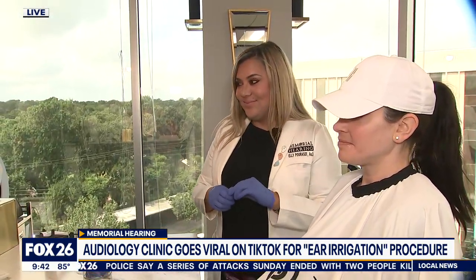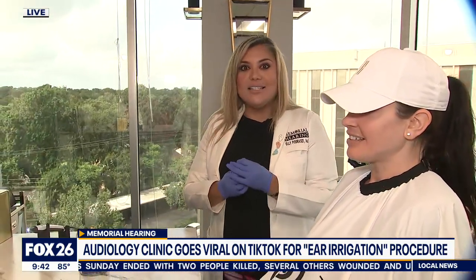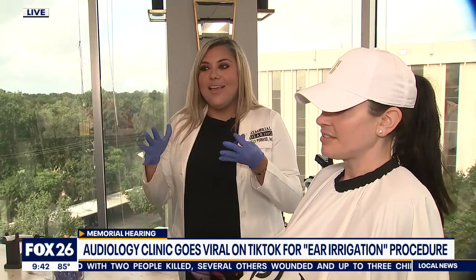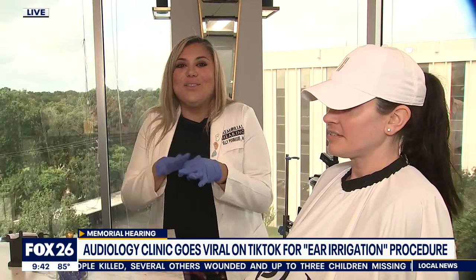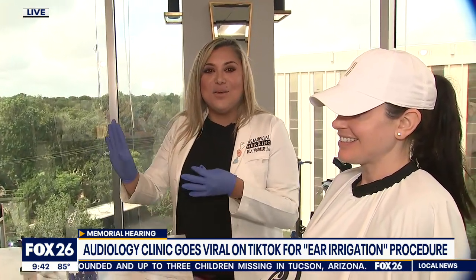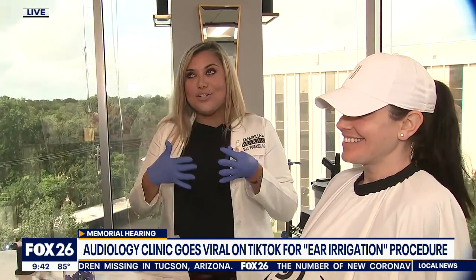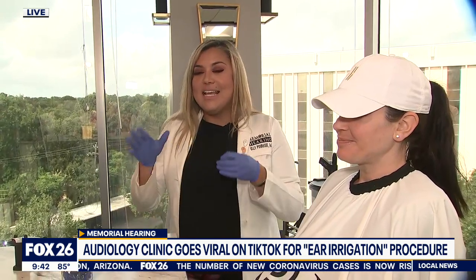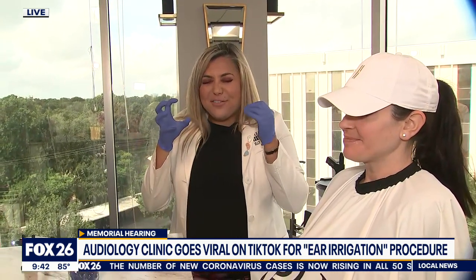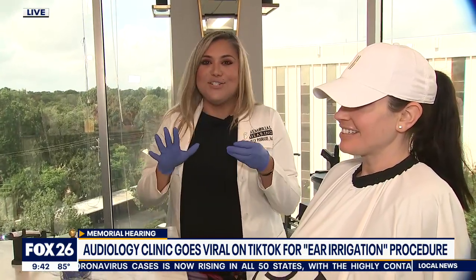Is your patient going to feel any pain when you do it? No — if there was pain, honestly, we wouldn't want to do it. We went into audiology because we don't like pain, we don't like to see blood. We picked the cleanest of all medical procedures. Part of why we started using this particular machine is because it doesn't cause pain. Most people — if you go on our TikTok you see everybody reacting — and we always ask, are you in pain? And they say no, it just tickles.